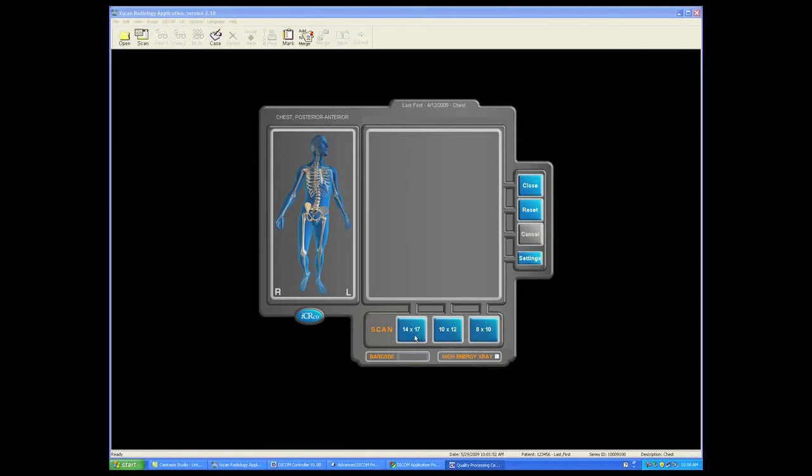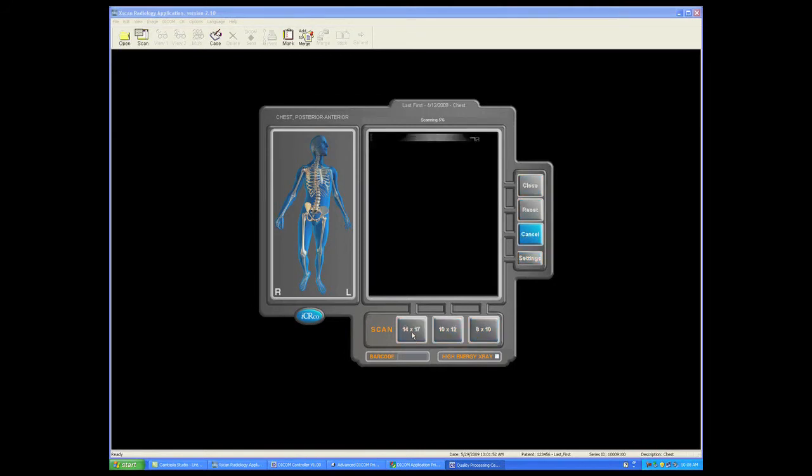So what we're seeing here is called the scanner preview window. We actually have the opportunity at this point to view the image in a preview mode, which is the raw image, so it will almost always look a little pale. But it'll let us know, did we choose the right anatomy? Did we get good positioning? Are we in the center of the field? Are we ready to go take our second and third exposures?